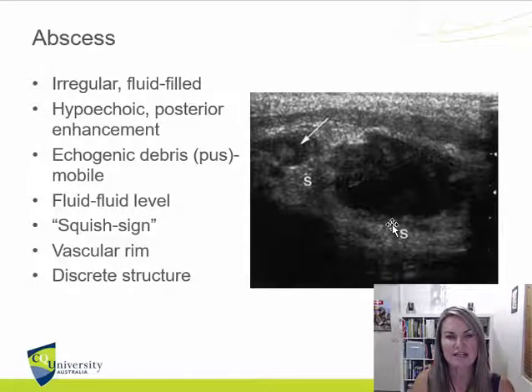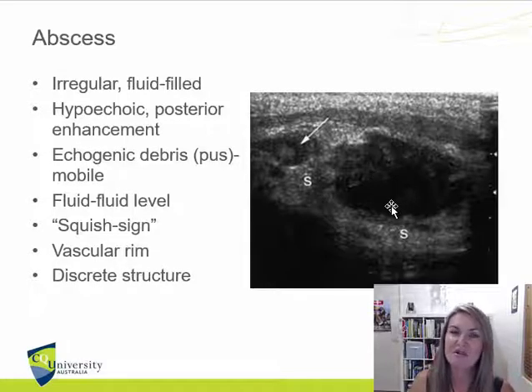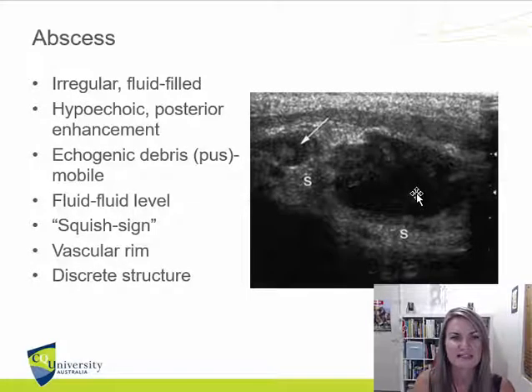The squish sign. Now, an abscess is going to be very painful for your patient, so you're not going to be poking and prodding very, very much. But the squish sign is actually just with a little bit of pressure that we're going to see these echoes start swirling and moving around a little bit inside.